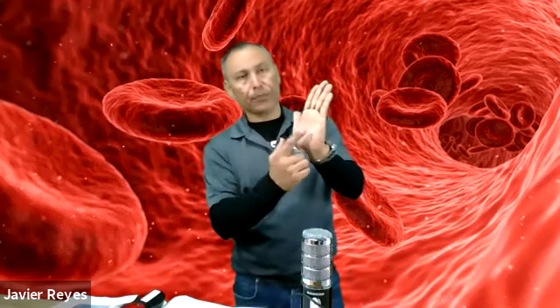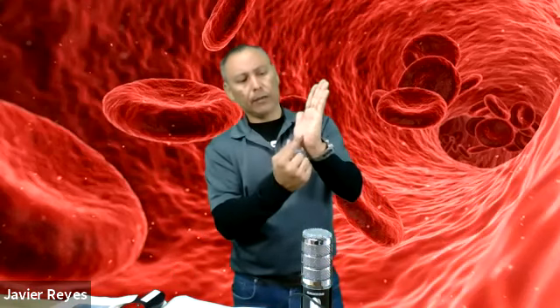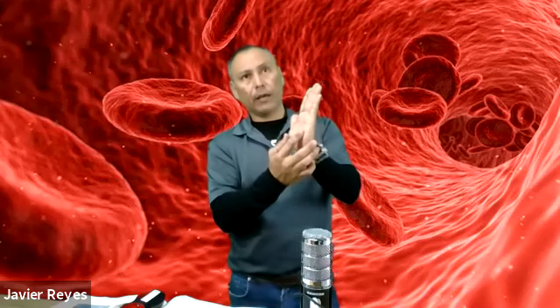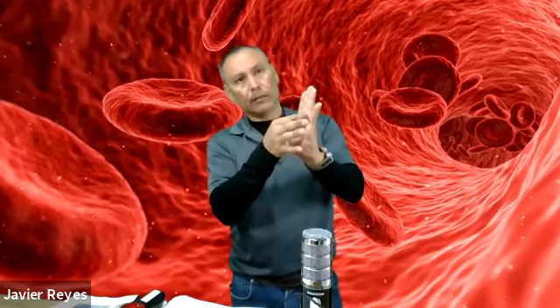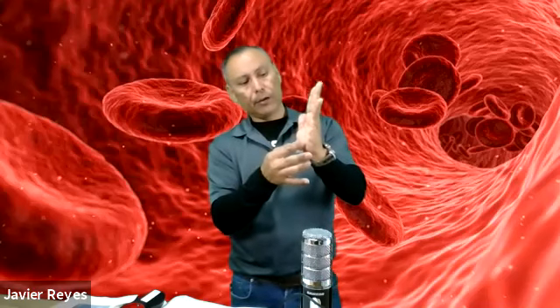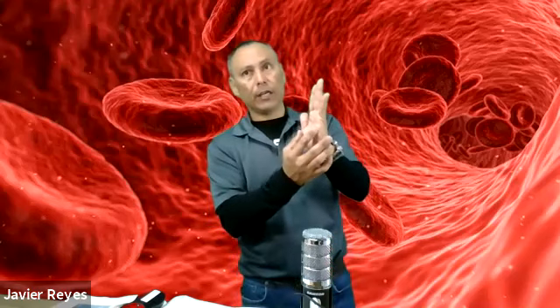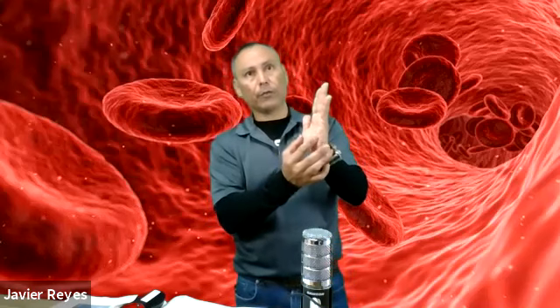In infants, use the plantar surface of the heel. So if you picture this as a baby heel, you have the sides of the heel, and here's the heel bone. You're going to look for these sides. You can create a V from between the first and second toe and between the fourth and fifth toe, and you're going to puncture on the sides of it. Again, you want to look for the lateral edge where it's fleshy and meaty. That's where you want to go in.